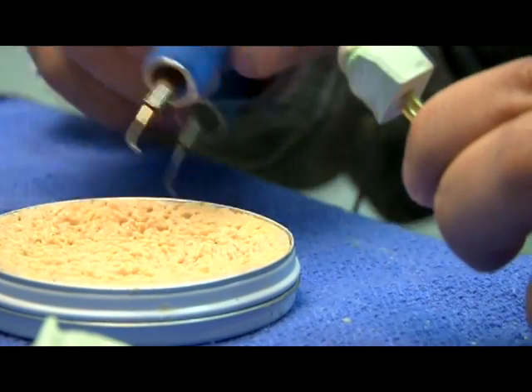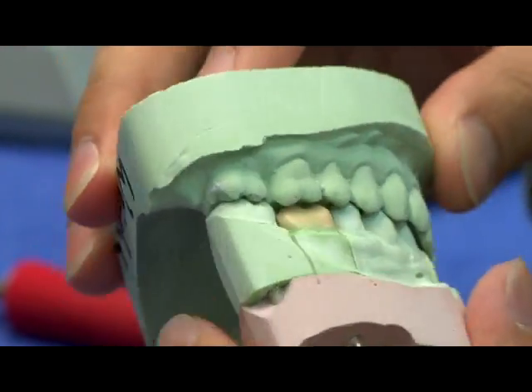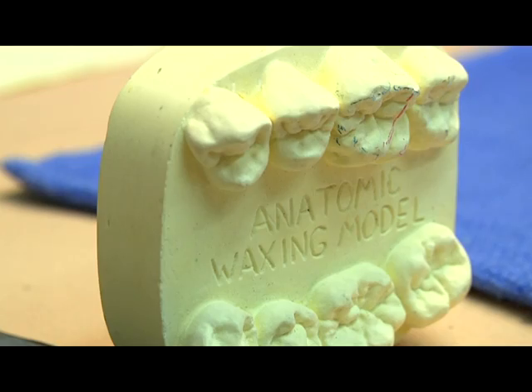You might need a crown to cover a discolored tooth, protect your tooth from breaking, or restore a broken one. Most military installations have a dental lab on site, unlike many civilian dental practices. Usually in the civilian world, labs are kind of their own entity. One of the benefits of being in the military is that we have in-house labs usually. It gives us a lot more flexibility with the restoration because we have the lab in-house.